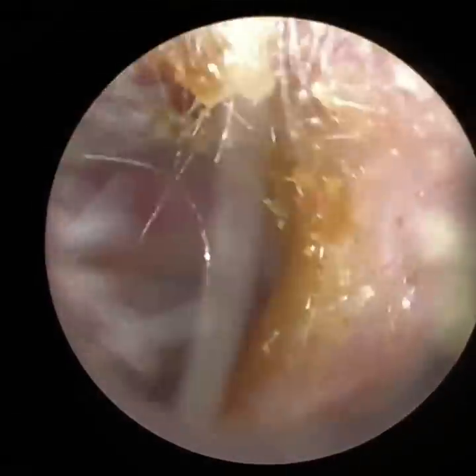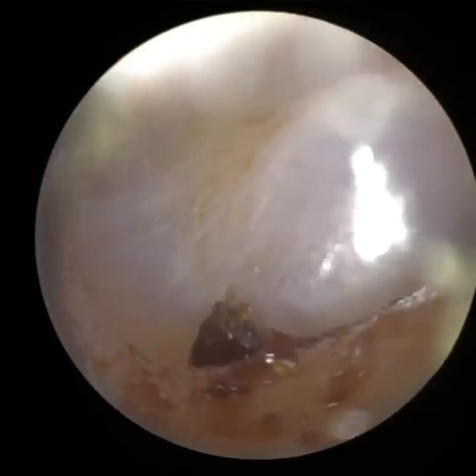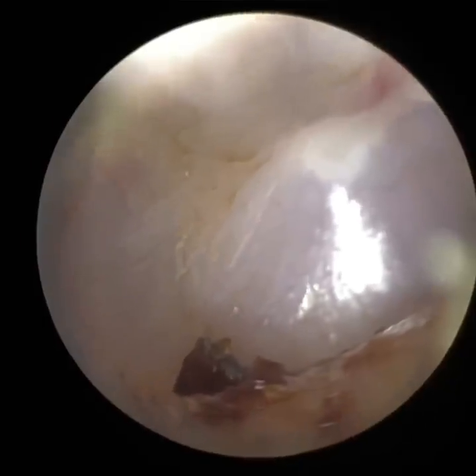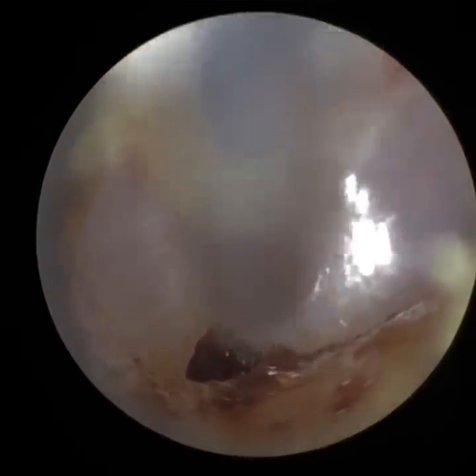Up and away. There is a little bit left — truth be told, we could have possibly just left that, but I just went in with a fine end. The patient was very still. And you can see those radial fibrous tissue on the eardrum.